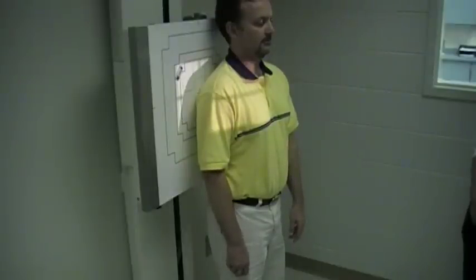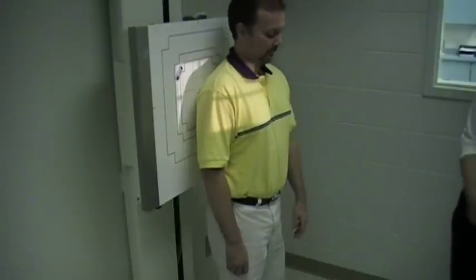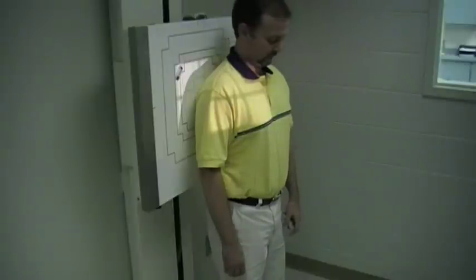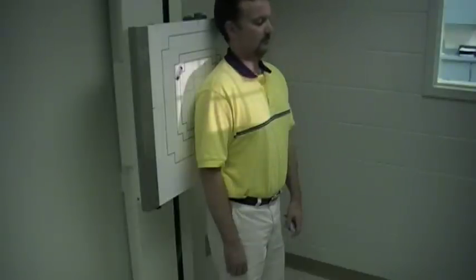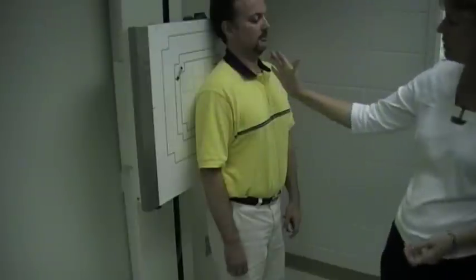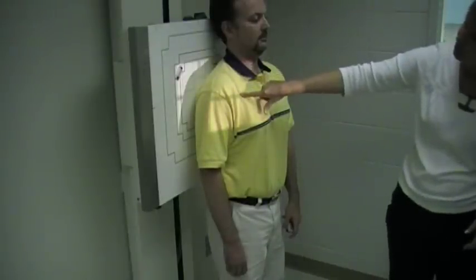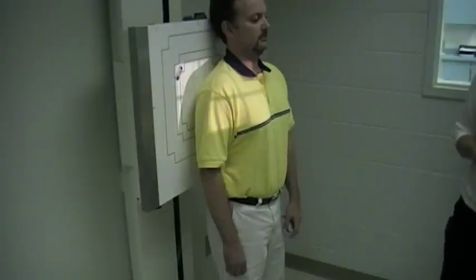Alright, we're going to do imaging of the shoulder. We're going to do the AP projection. You're going to have a 48 SID. Patient will be standing. You'll be using a 10 by 12 cassette, and you'll have the cassette going in crosswise. Central ray will be 1 inch below the coracoid, and we will do 3 arm rotations for this.